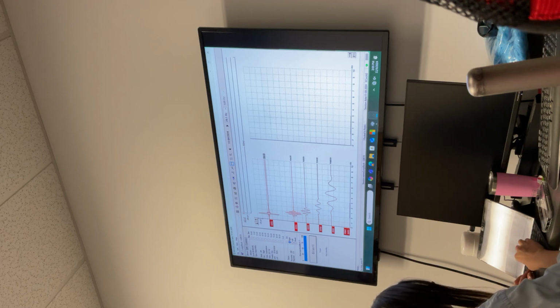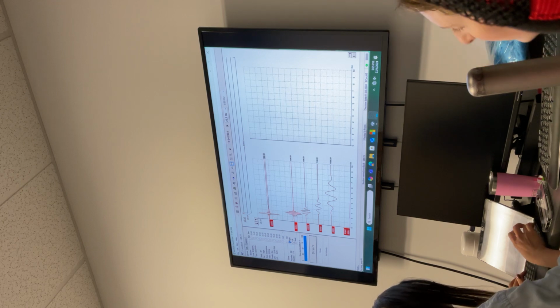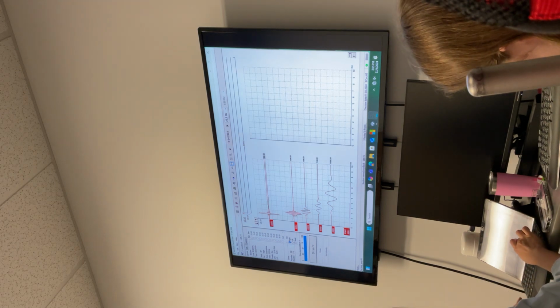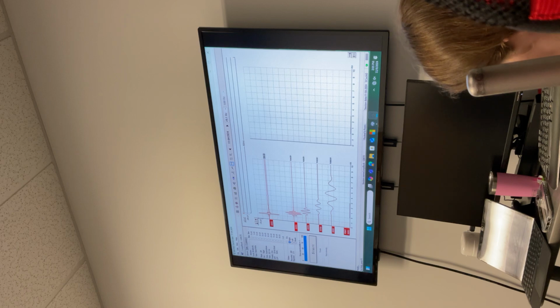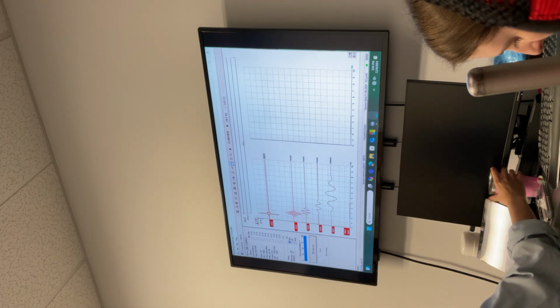Got it? So for chirp, 0 is not the onset, but for tone burst it is. Tone burst and click. 0 millisecond on the recording window.